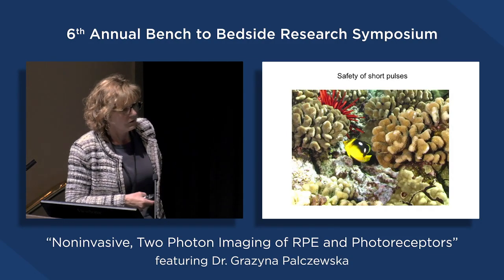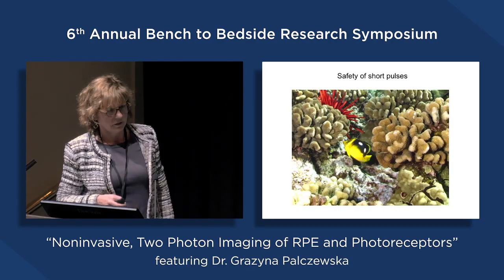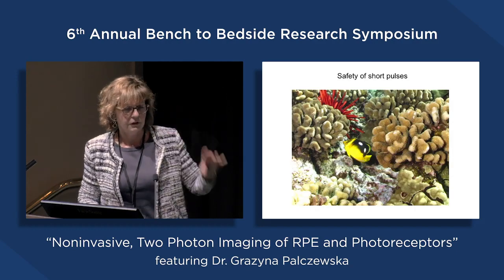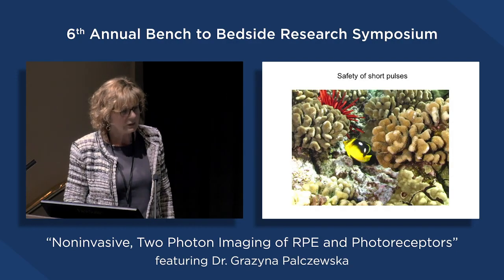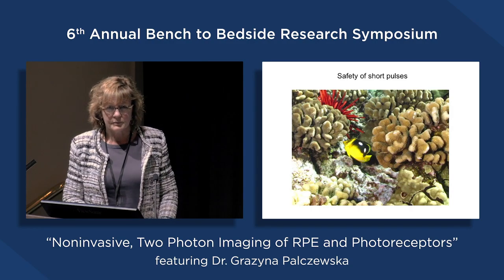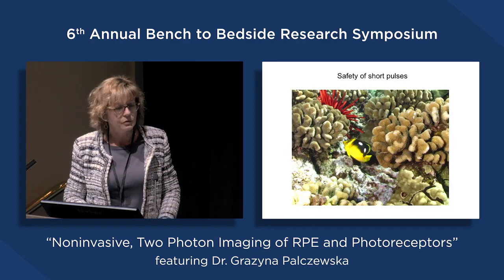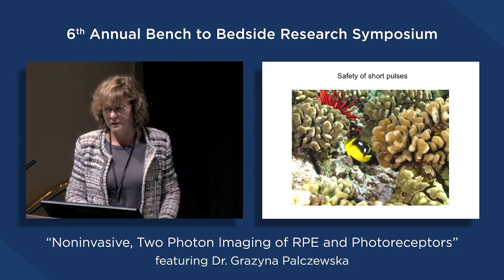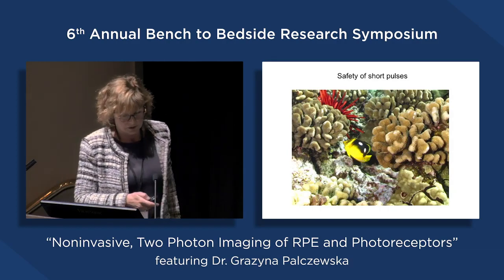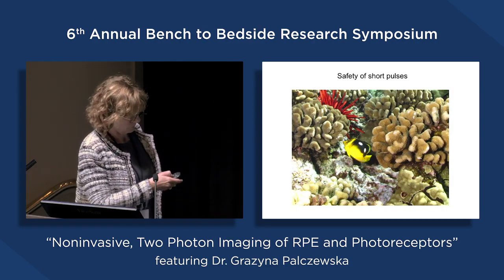All right. However, one caveat with the safety recommended by the American National Standards Institute is, if you look very, very carefully through this thick book, it says that for pulses that are shorter than 100 femtoseconds, there is a lack of biological data. So we should use the recommendation for pulses of 100 femtoseconds. So really it is up to the researchers to prove that those are safe.